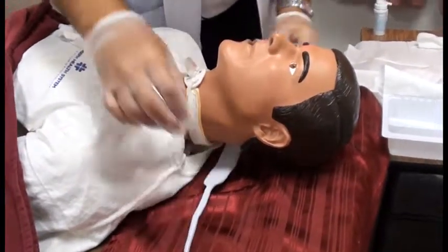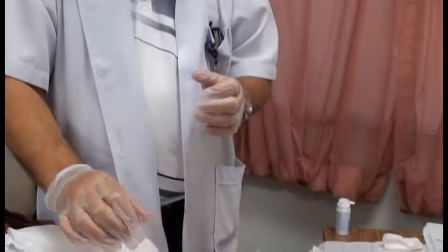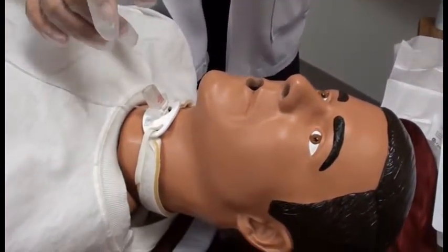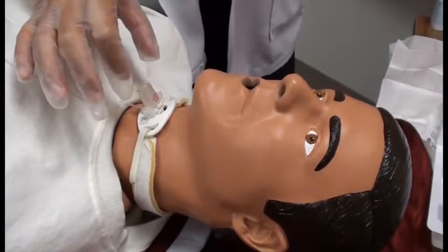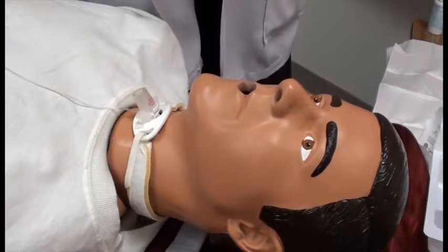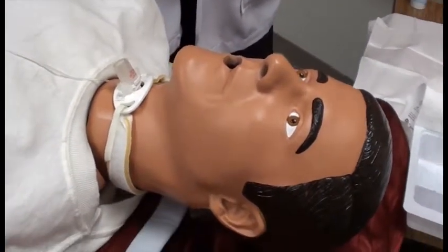Okay, now we're going to be removing the existing trach tie. Now, I'm not suggesting that you guys do this, because keep in mind that anytime you manipulate the trach or the inner cannula, that can cause the patient to cough. So we have to make sure that the tracheostomy is secured all the time. You can ask a family member to assist you in this process.